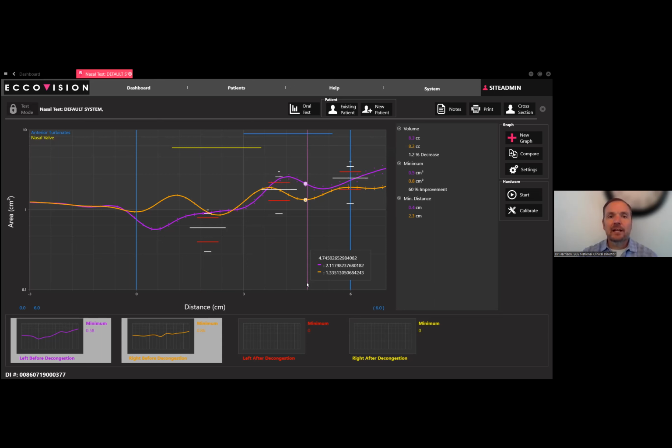The other analogy that I'll use when teaching is, if you think of a bat that's flying in a dark cave, they can't see all the stalactites that are hanging from the ceiling or the walls of the cave, but they never hit anything. So they're doing a very similar process of sending out echoes, and their brain is processing that information so they don't run into stuff.